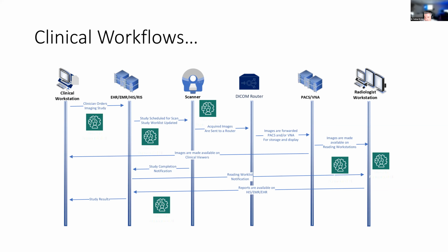For example, in an ED setting, you might be ordering and reading right there, or you may be scanning without an order. The ED scanner may have privileges to create its own orders and such. So this can be more complicated. I was trying to give a rather simplistic view of the flow. And within this flow, AI algorithms can be integrated in multiple places. So we're getting into integration into this environment.